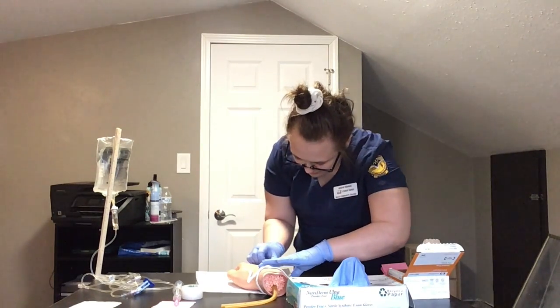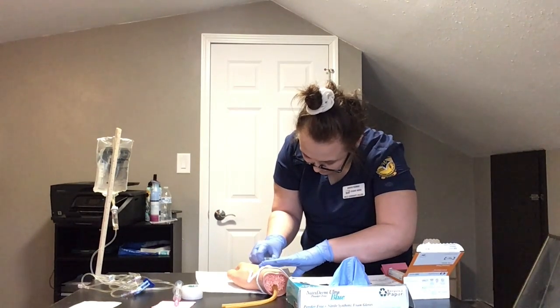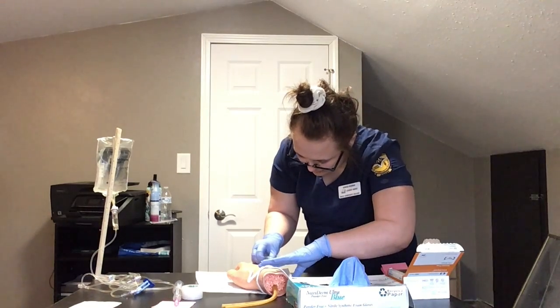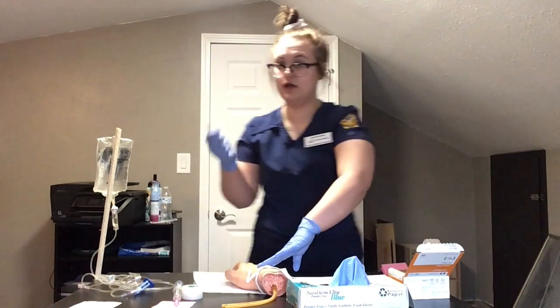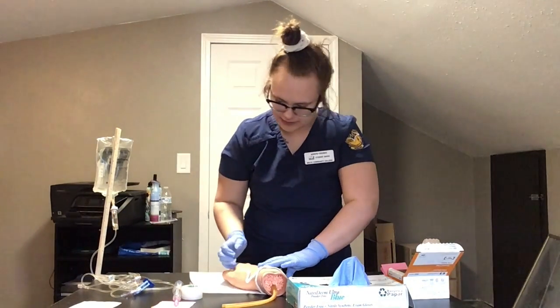I'm going to place this in, bevel up, and I'm going to go slowly until I get flashback. And when flashback occurs, I'm going to start to advance the catheter without the needle in it. So advance it slowly, and then once it's in there, I'm going to make sure to secure my needle and throw this in a sharps container. So that's in a sharps container.